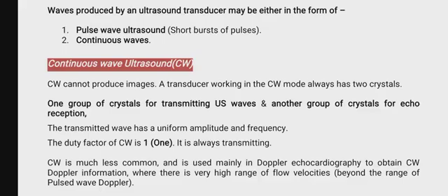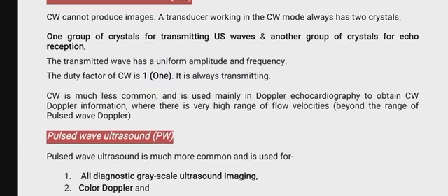The transmitted waves have uniform amplitude and frequency. The duty factor of the continuous wave is 1. In other words, it's always transmitting. So there are dedicated piezoelectric crystals that generate ultrasound waves continuously, not in bursts. And there are also crystals dedicated to listening to the echoes, unlike in pulse wave, where the transducer will generate and listen.